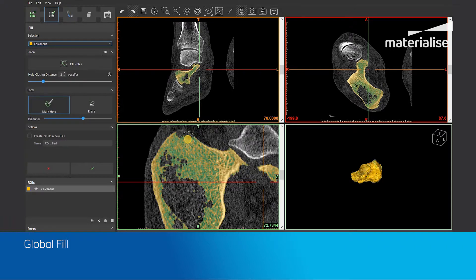To fill up these regions you can choose to run the global fill again with a higher parameter while being careful not to lose certain details. Or you can also use the local fill to fill up the remaining holes manually. Let me show you how you can use the local fill in this case.